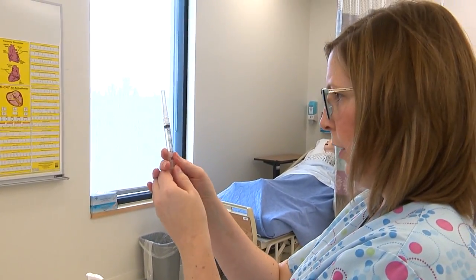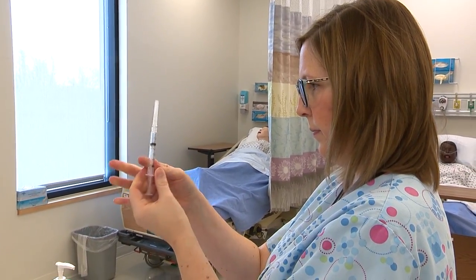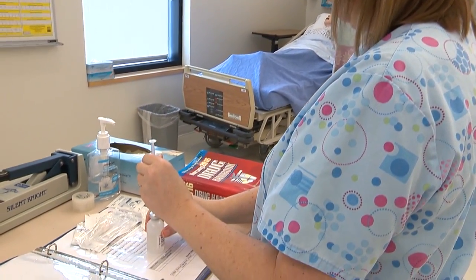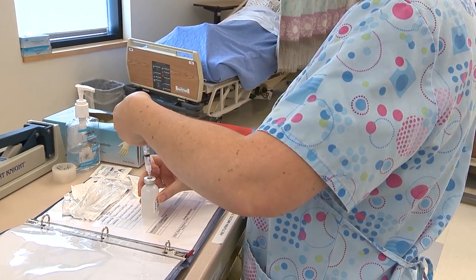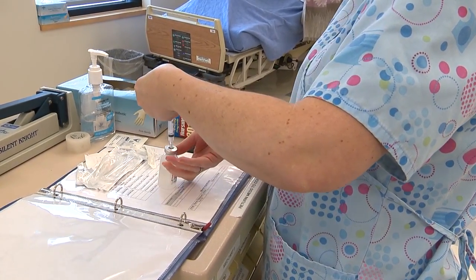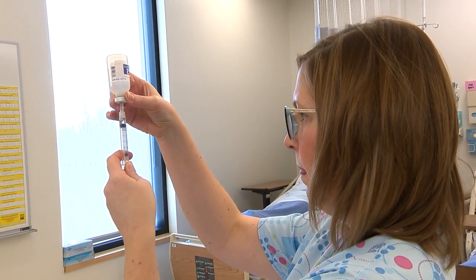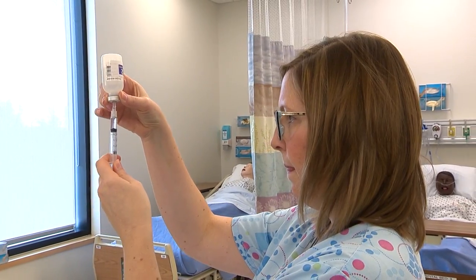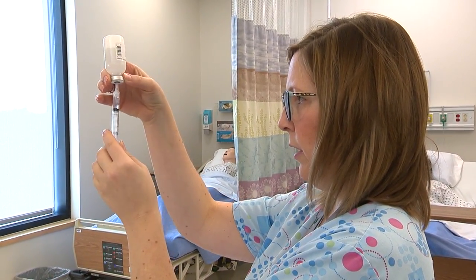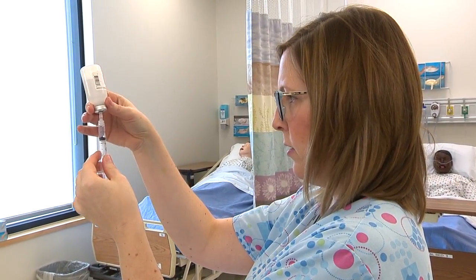I'm going to draw up 1 ml of air since I'm giving 1 ml of medication, then inject the air. Remember to inject air to air and not air to medication, otherwise you're going to get a bunch of bubbles. Now I have 1 ml drawn up and I do not see any air bubbles in my syringe.